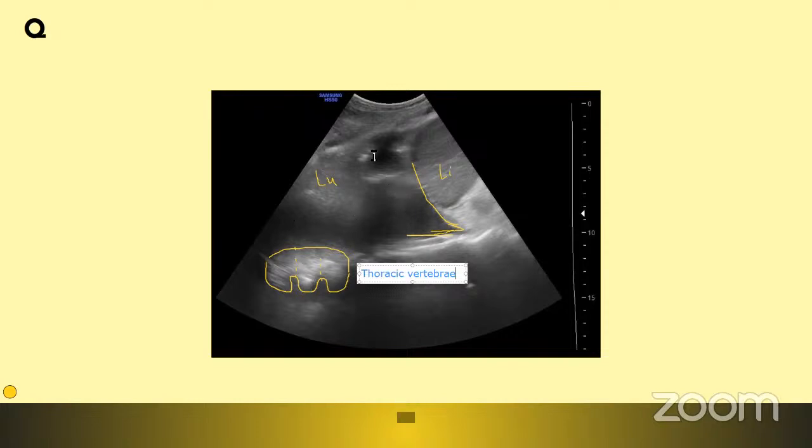So the medium in which it travels must be fluid. In air, it would rapidly lose its energy and attenuate much faster. In fluid, comparatively faster and with less attenuation, I would agree. So we are having posterior acoustic enhancement. It denotes that we are having some kind of fluid just superficial to the structure, or anterior to it in anatomical terms.